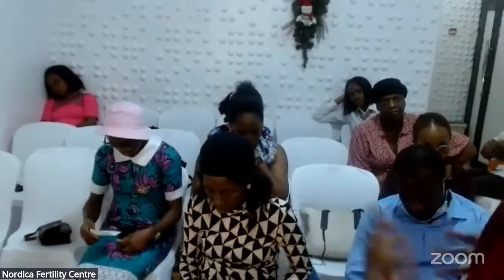And I will also use this to answer the question about recurrence. With any procedure that does not involve removal of the uterus, in as much as the uterus is still present, you have that risk of having new fibroids coming up in the future. So with Hifu, once we treat the ones that are there, they are dead, they continue to reduce in size. If new ones come up in the future, you can always benefit from repeat treatments of those fibroids. Next slide.